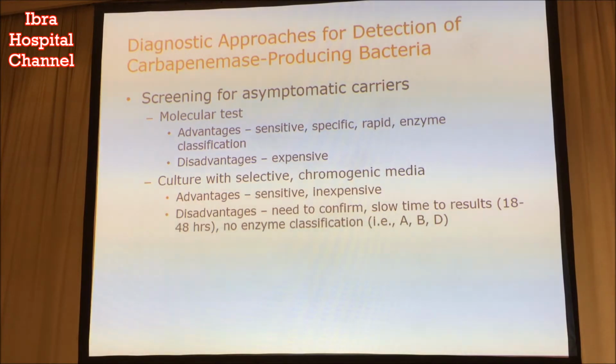Now, there's a number of alternative ways in which you can recognize that you have a carbapenem-resistant organism. I've talked about MICs, or you can talk about disc diffusion tests, and you understand what the limitations are there. So you need an alternative test to help be able to demonstrate that even though it's supposed to be susceptible, it truly is a carbapenemase-producing organism.